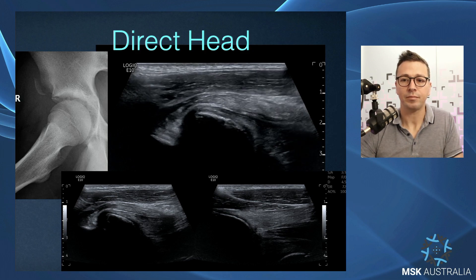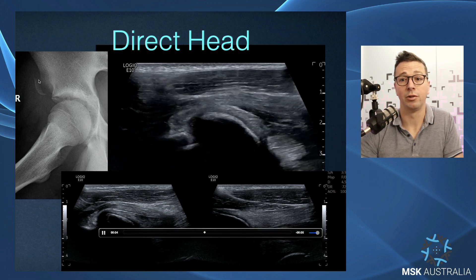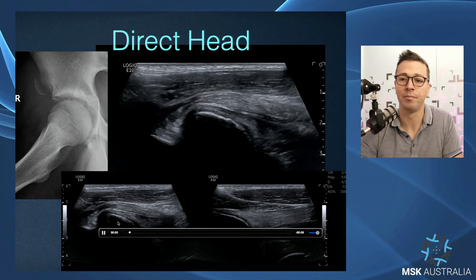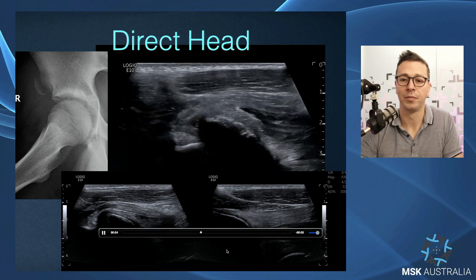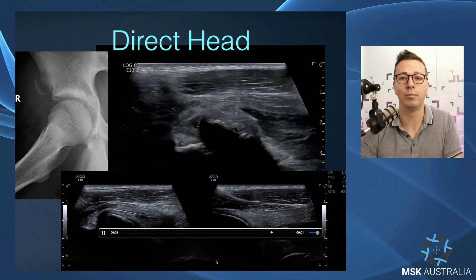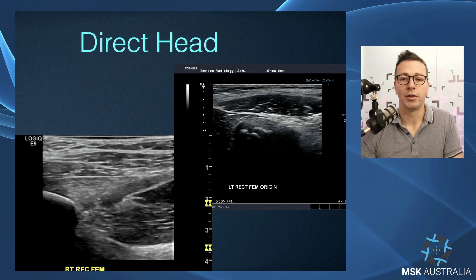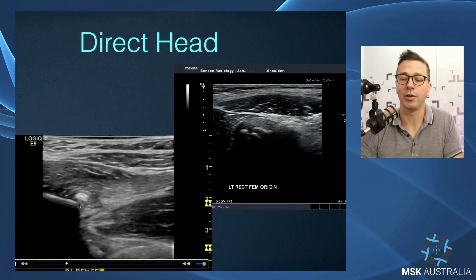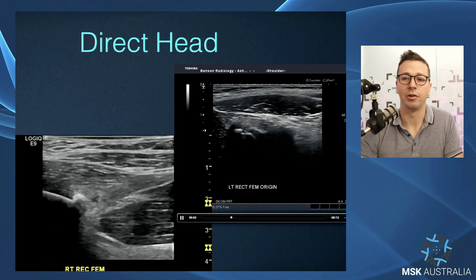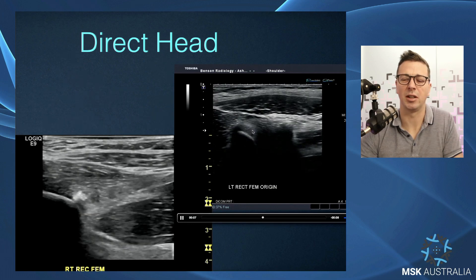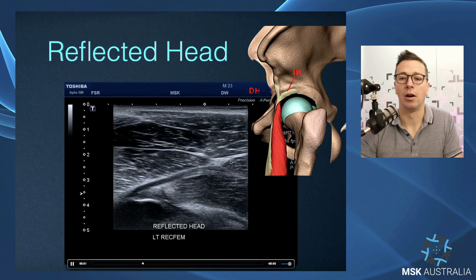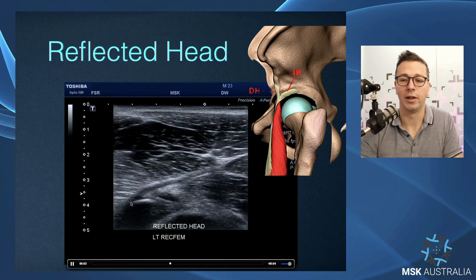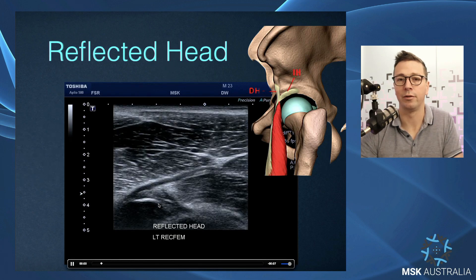Next, rectus femoris pathology — a tale of two heads. For the direct head, the most common pathology is avulsion fractures in pediatric patients, apophysitis, or apophyseal fractures — they pull the apophysis of the direct head of rectus femoris off. Comparison to the other side is useful. You can also have calcific tendinopathy of the direct head — a crystalline inflammatory process — or degenerative enthesopathy with enthesis-based calcification and delaminations within that tendon.